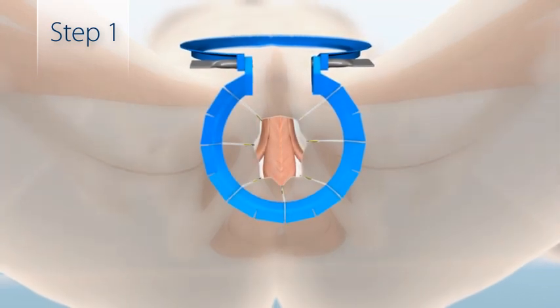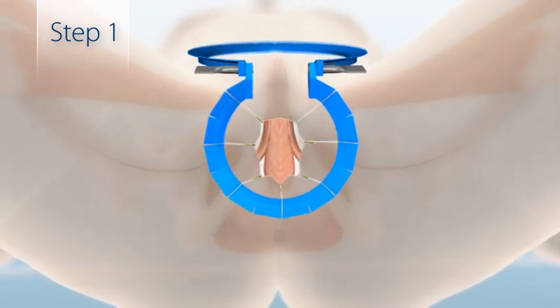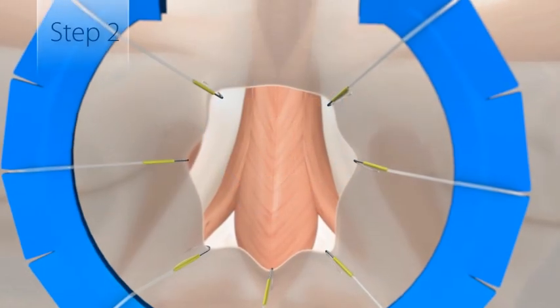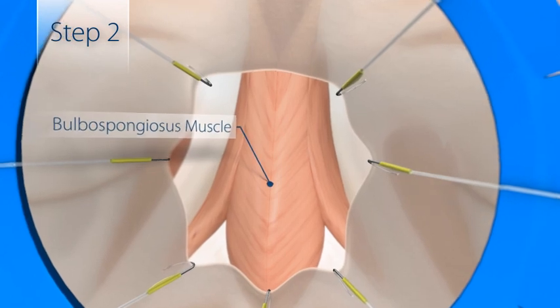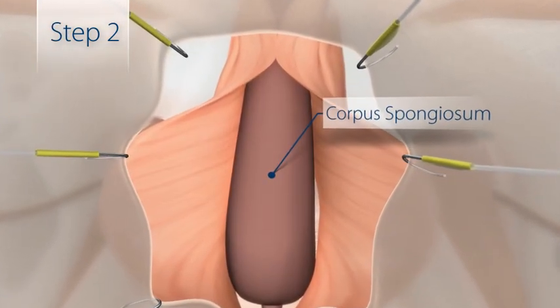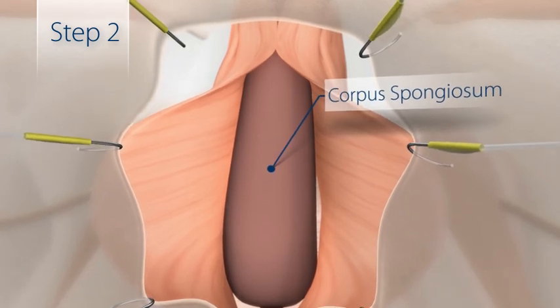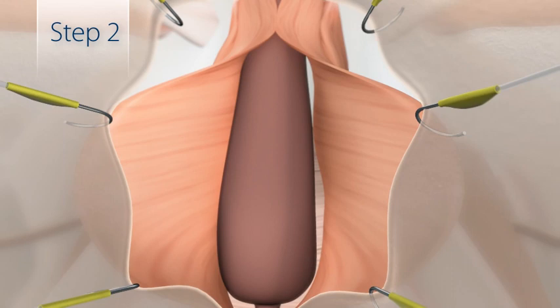The procedure begins with a low midline perineal incision through the skin and subcutaneous tissues. Next, the bulbospongiosus muscle is opened along the midline and reflected laterally to expose the corpus spongiosum. To allow mobilization of the bulb, dissect laterally between the muscle and the corpus spongiosum.